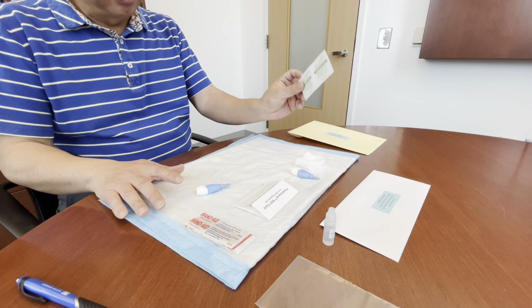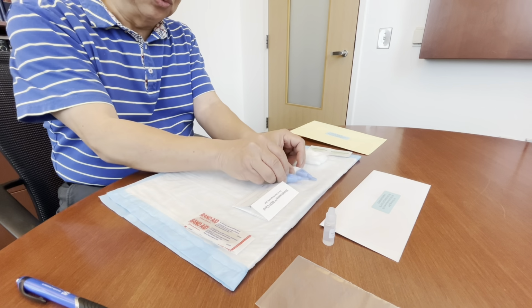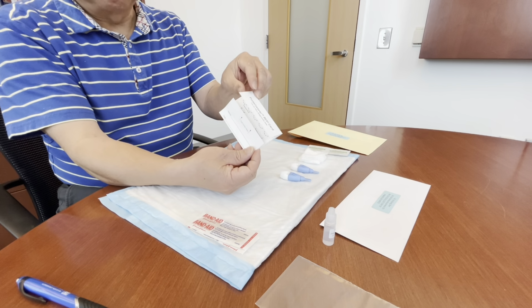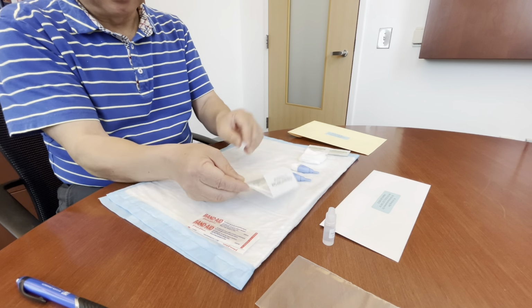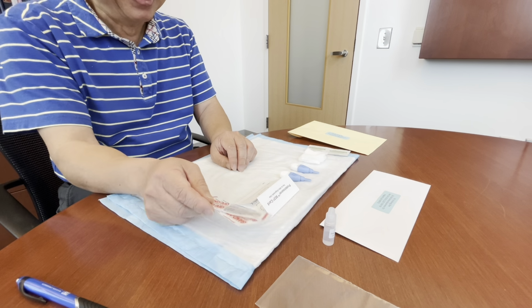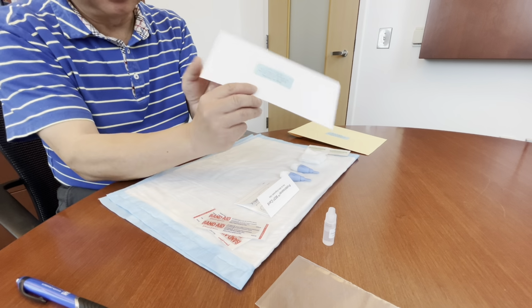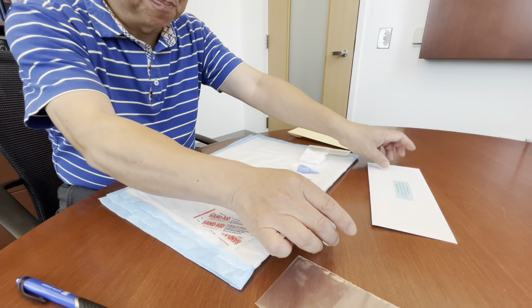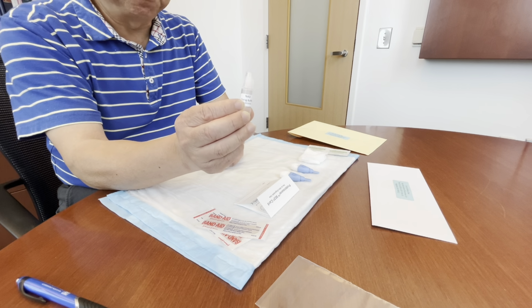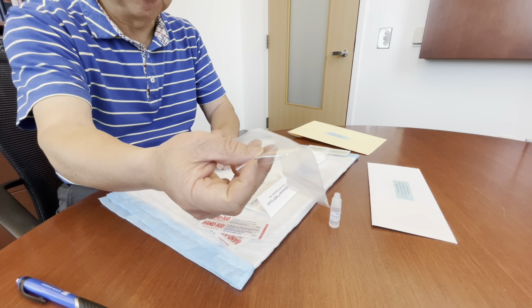Your kit contains alcohol pads, gauze, 2 lancets, a filter paper collection card, and bandages. We also provide a return envelope with our address on it, a bottle of NAD fixing buffer, and a sealable plastic bag.